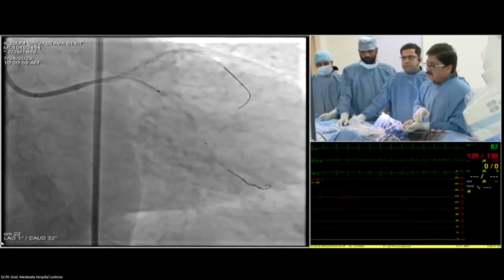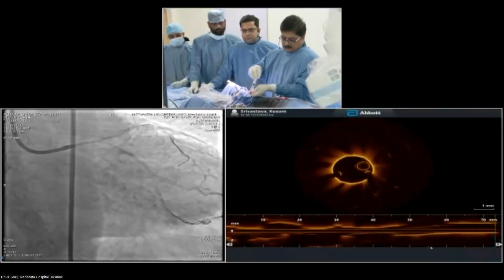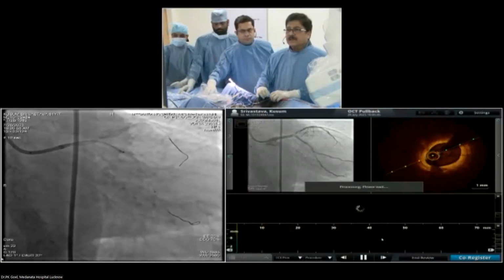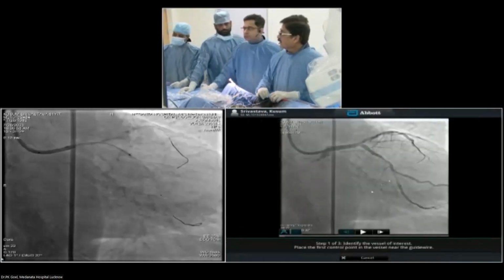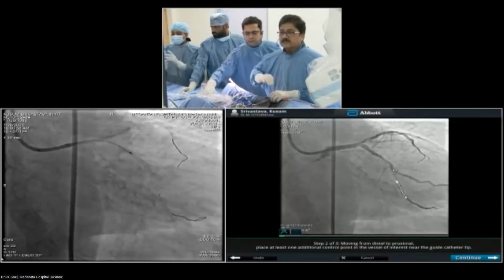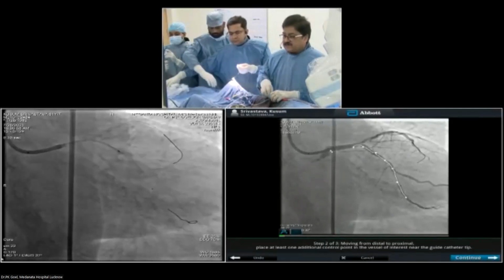Dr. Sunil Modi, what do you think about EBC main results? Some echo. Not able to hear. EBC main. Okay. Can we see the OCT now? Yes, you can show the OCT. After that, we can talk.